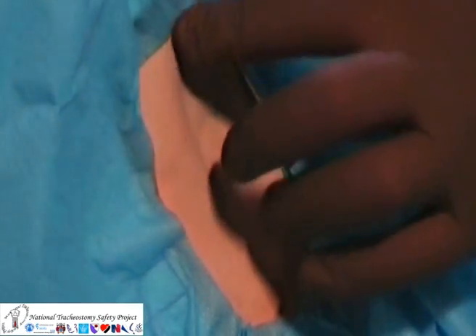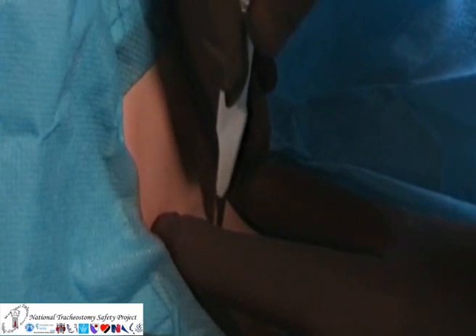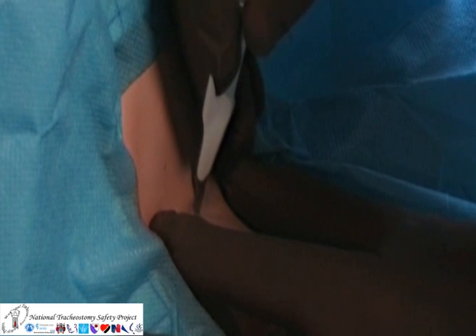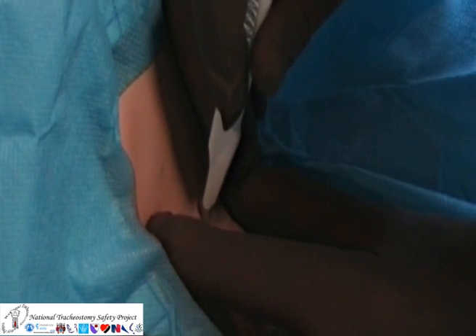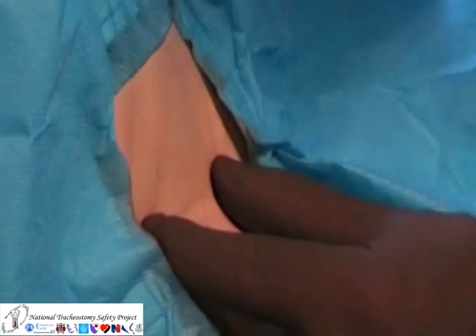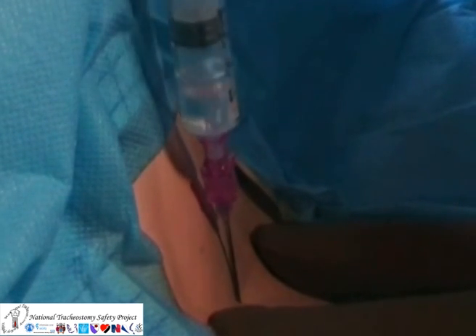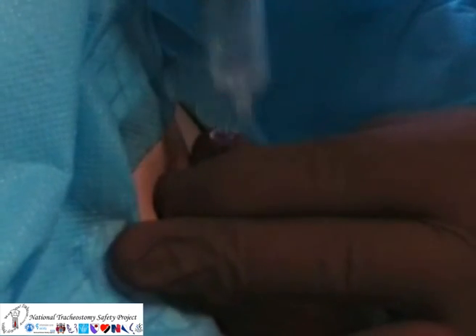After identifying the structures in the anterior part of the neck, a small vertical incision is made over the cricothyroid membrane. The cannula is then inserted through this incision, attached to a syringe with a little saline in it. Aspiration of air, seen bubbling here, confirms correct placement of the needle within the trachea.